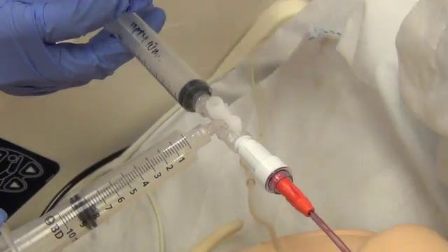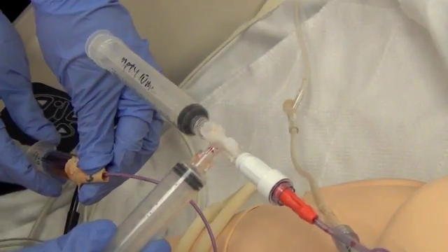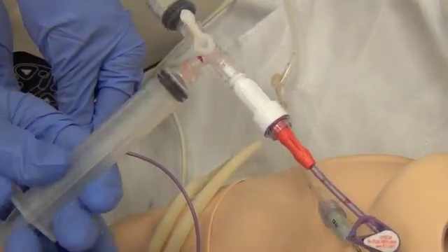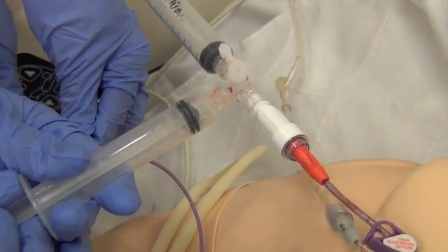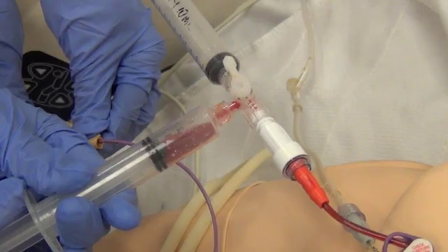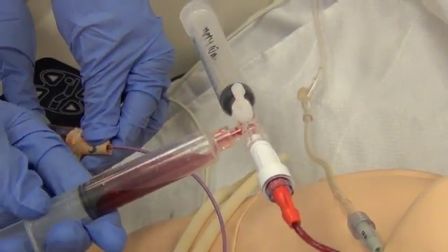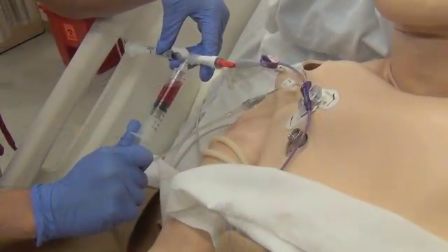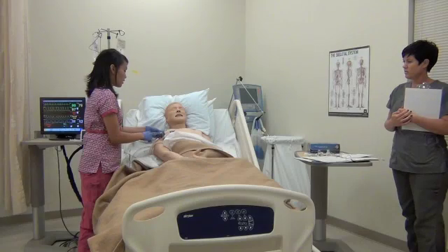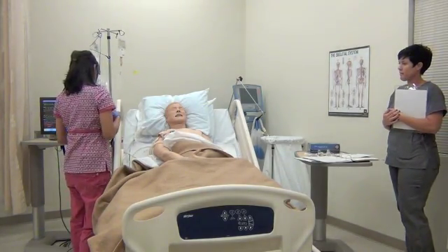Allow Cathflo Activase to dwell in the catheter for 30 minutes. Then turn the stopcock off towards the Cathflo Activase syringe and attempt to aspirate blood into the empty syringe. If able to aspirate, withdraw 5 milliliters of blood. Aspirating removes Cathflo Activase and the residual clot. Gently irrigate the catheter with 20 milliliters of normal saline. The nurse is now able to administer the medication to the patient.